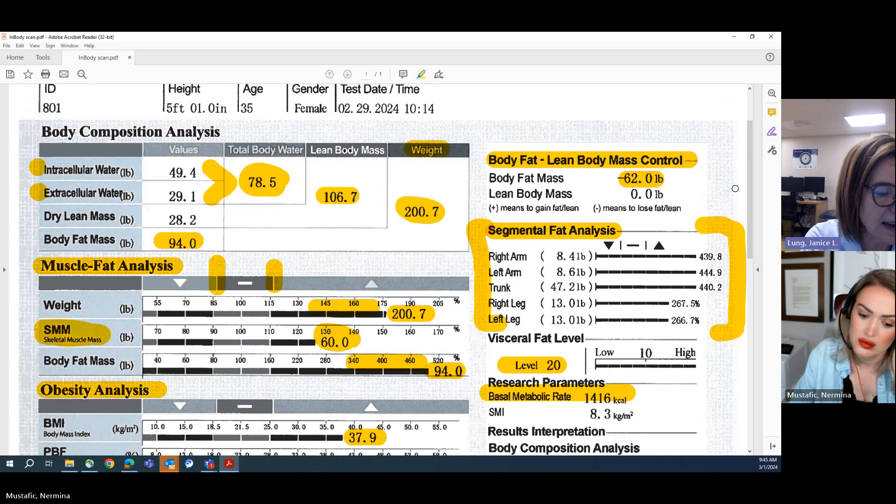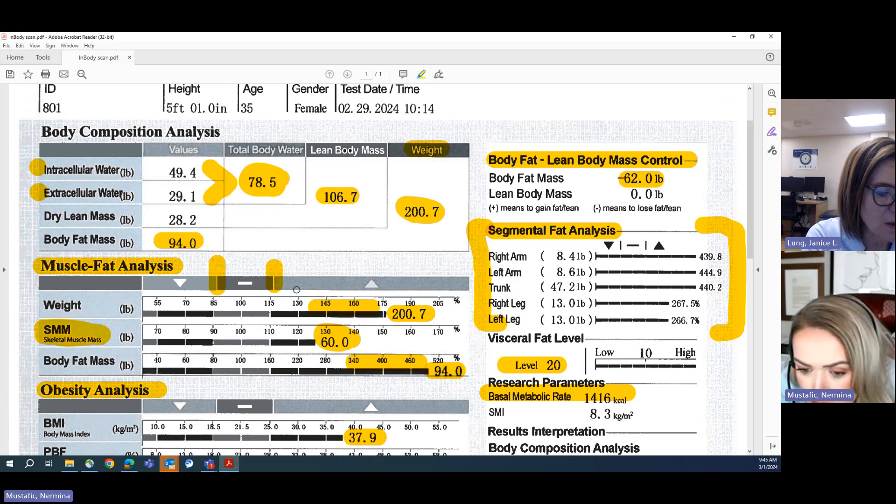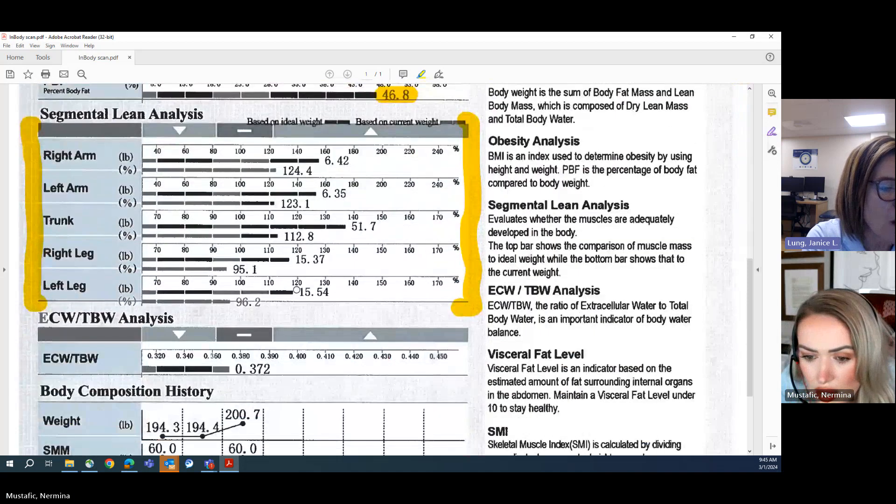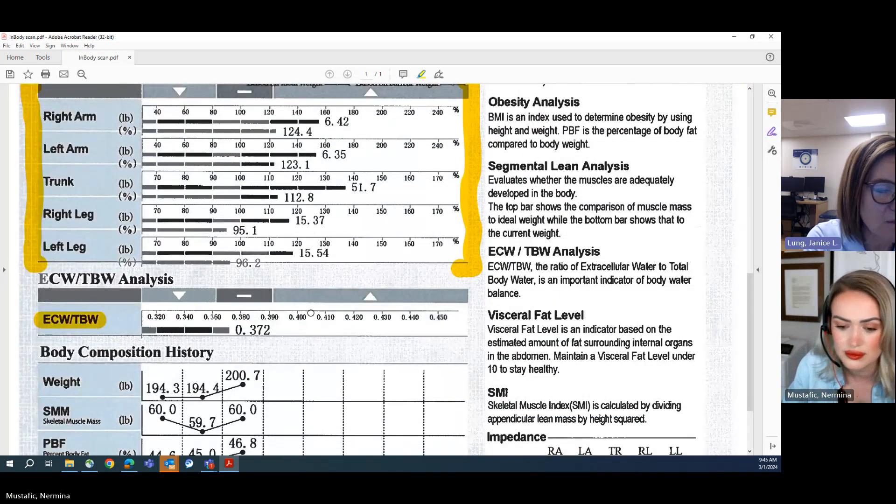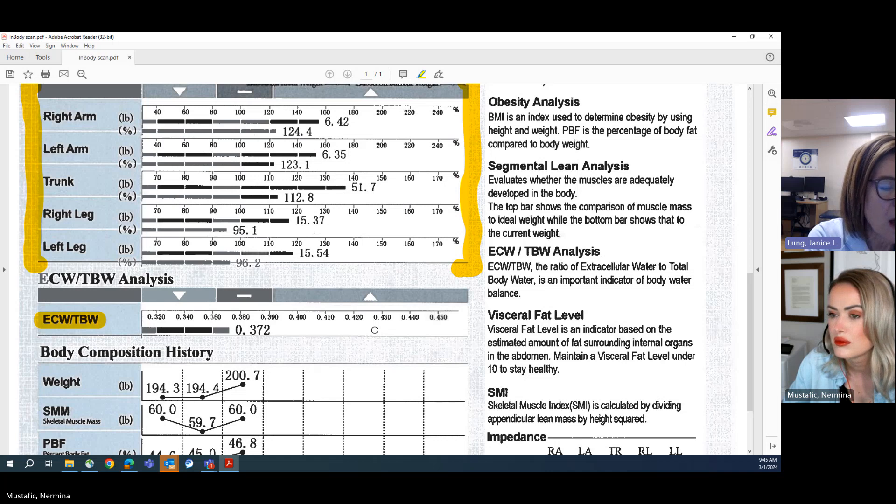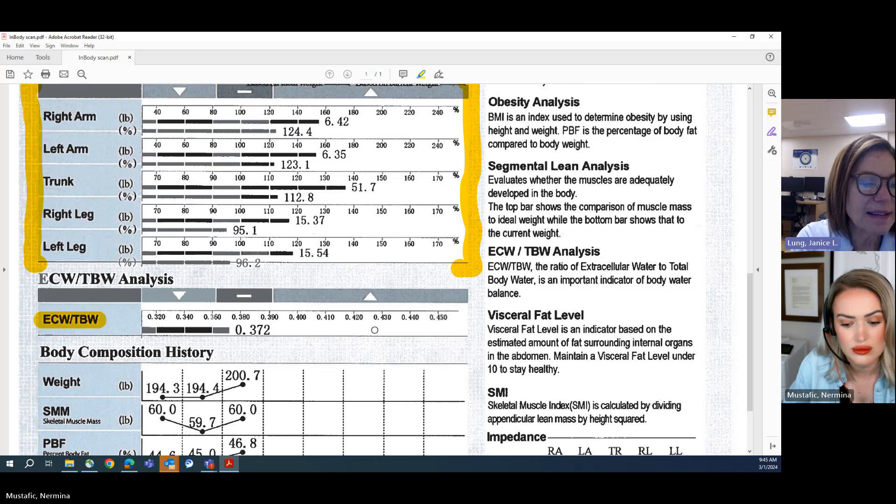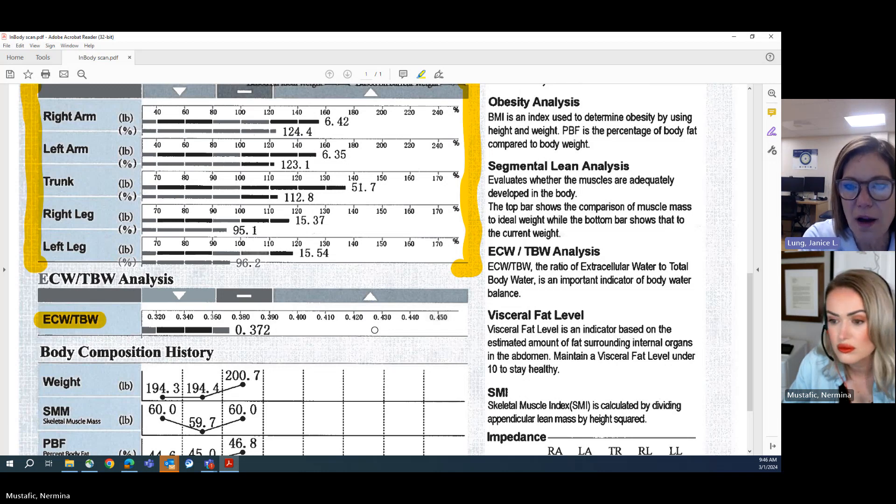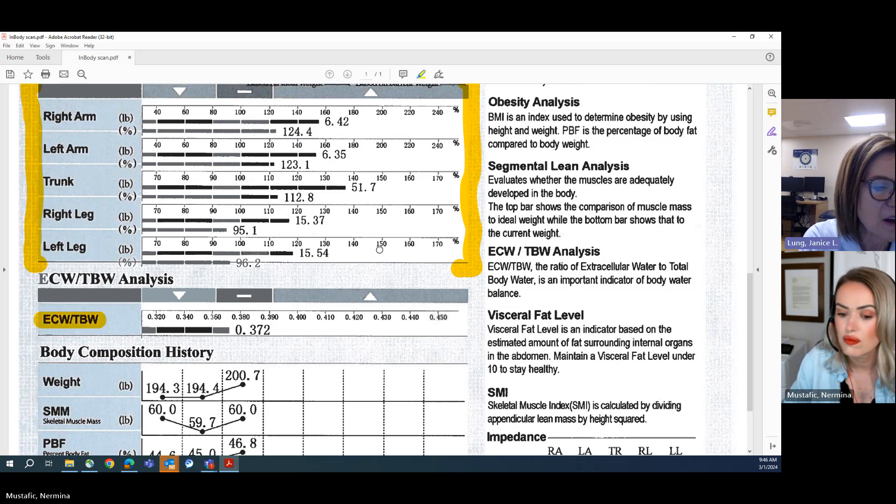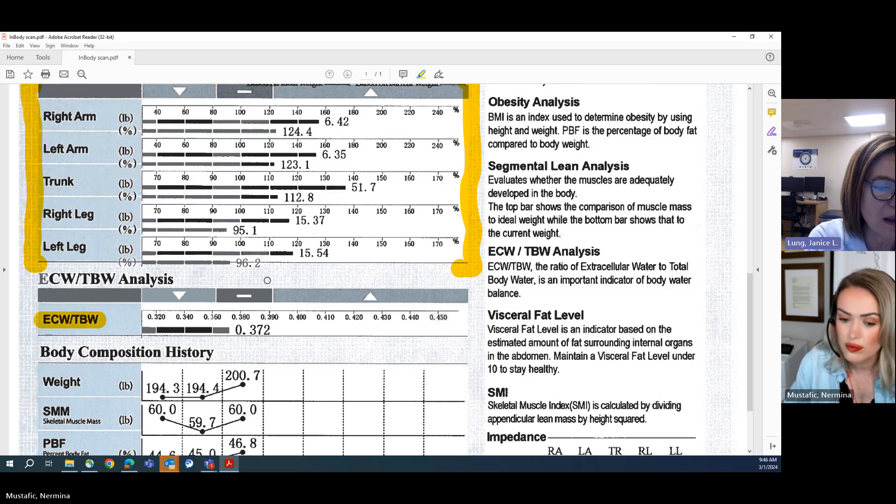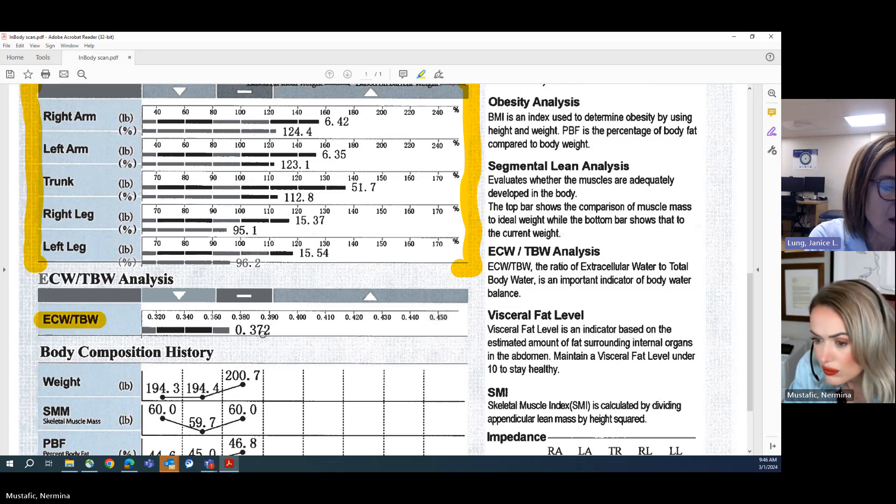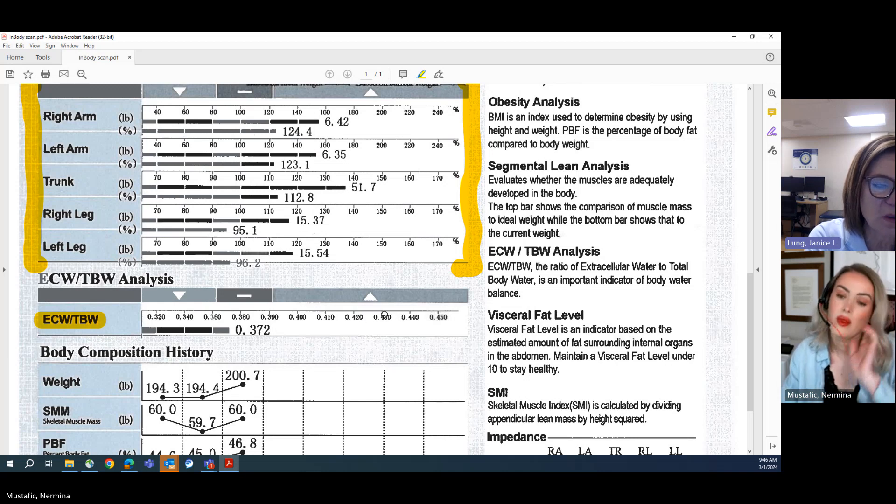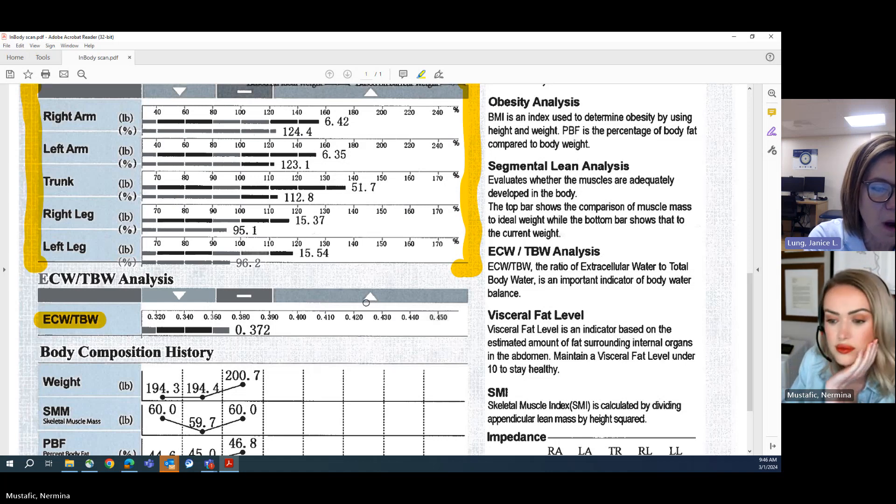Let's scroll back down again and look at the water. So scroll back down on the sheet and we'll see this is a ratio of her extracellular water to her total body water. And right there we can see, first of all, she's right there in the sweet spot. Everything is as she would love for it to be. This is just a ratio. What this informs her is that she doesn't have a whole lot of water hanging out outside of her cells. So she's not retaining water. She doesn't have inflammation or an injury. If that were the case, her ratio would be way outside of that healthy range. If she were dehydrated, she would see her number be a little bit too low, lower than 0.36. So this is just a nice confirmation that this person is well hydrated and she's not retaining a whole lot of water.